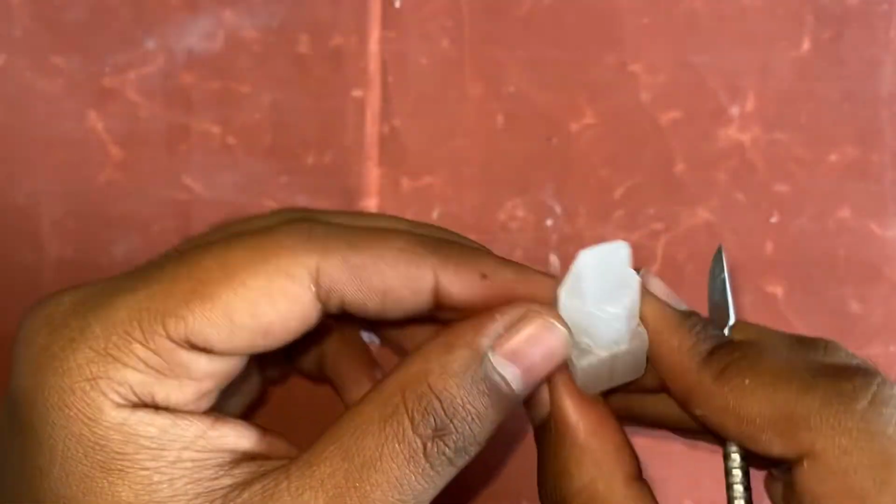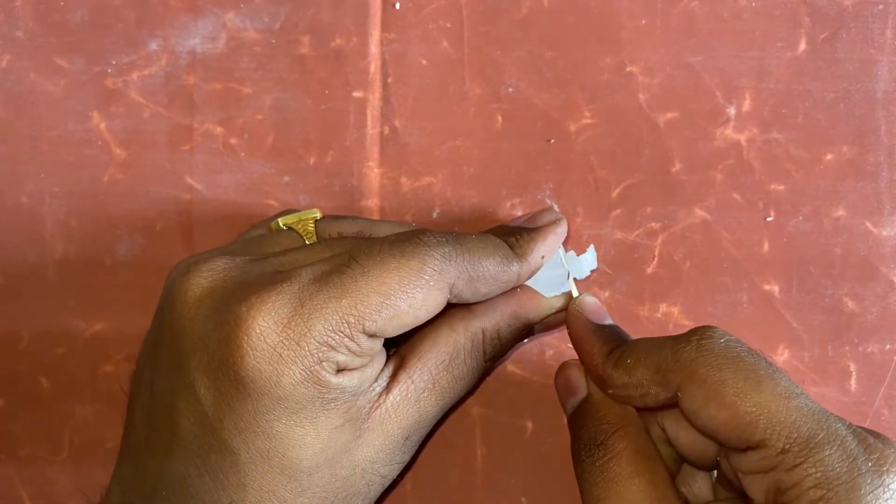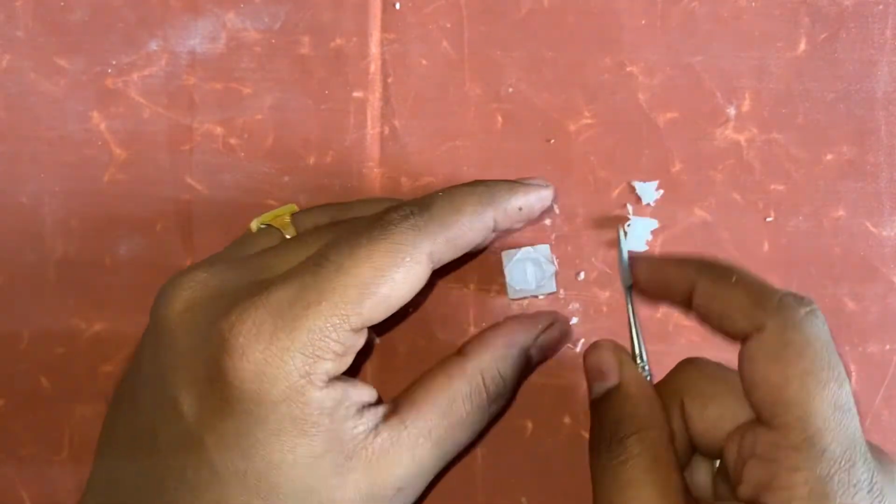After removing the wax from the corners, now come to the sides. So gently remove the wax from all the 4 sides.